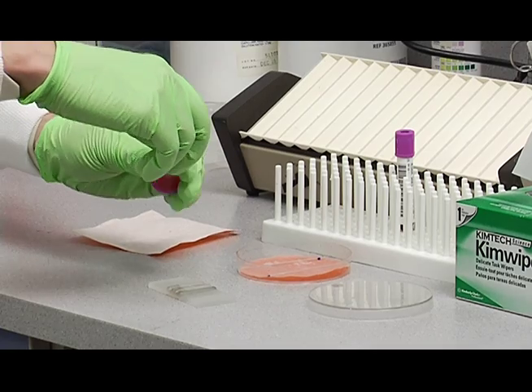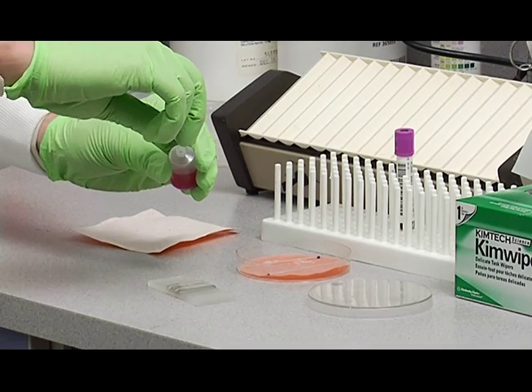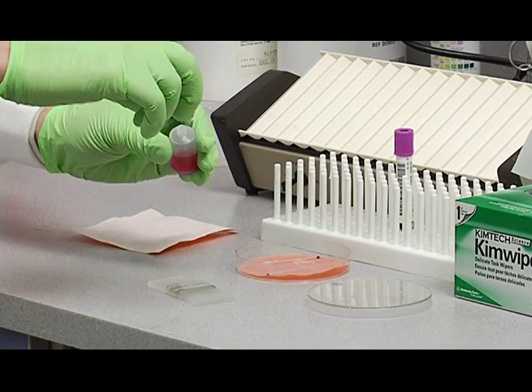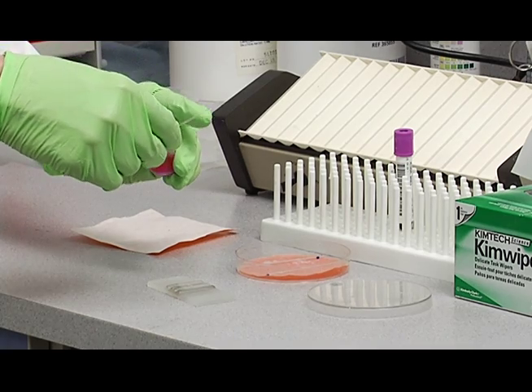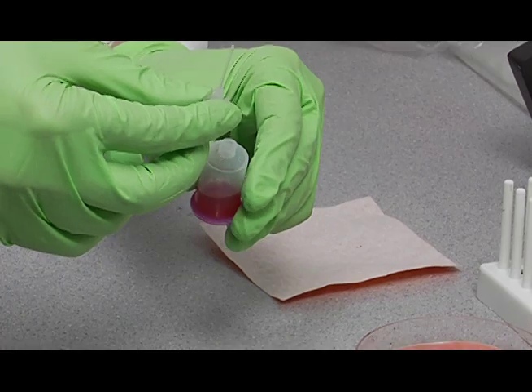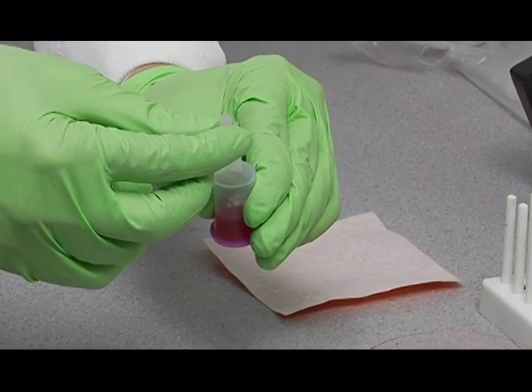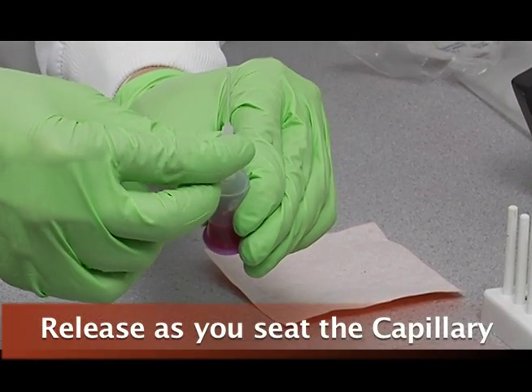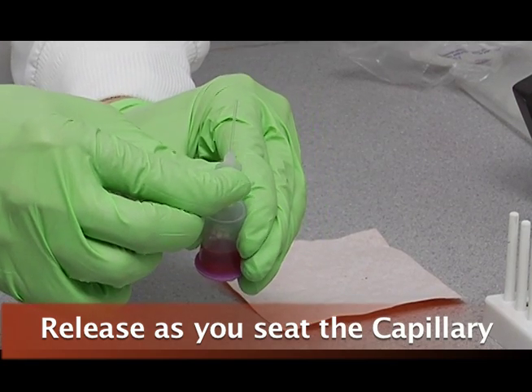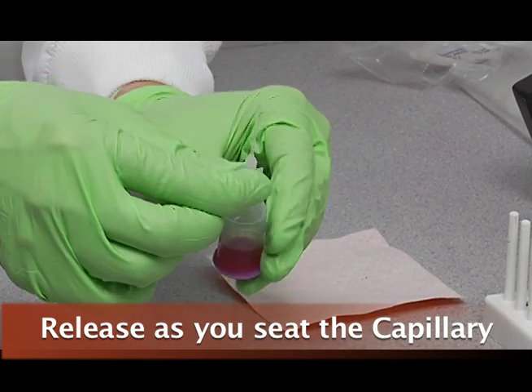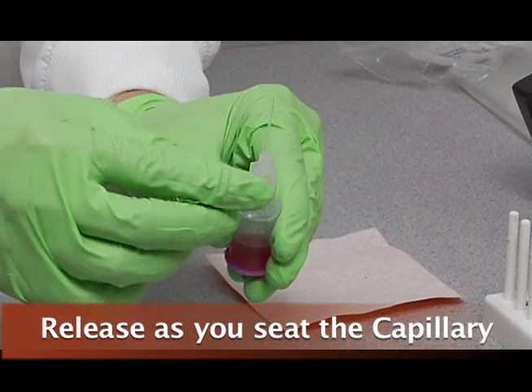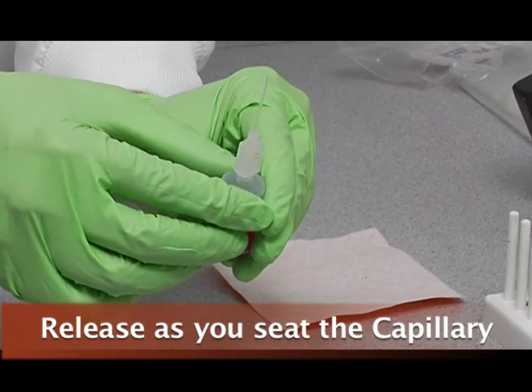Then remove the capillary. There'll be a little bit, sometimes a little bit of diluted blood in here. There isn't in this particular case, but if there is, you don't want that to squirt in your eye. So what you want to do is squeeze the reservoir and then release it as you seed it in, and it will suck the liquid back into the vial.